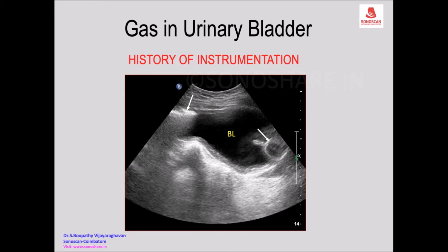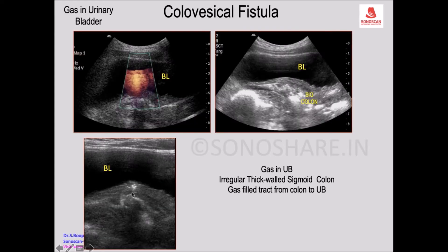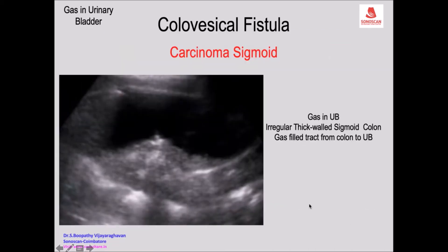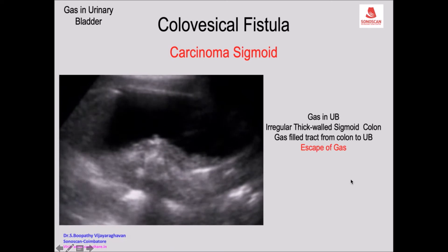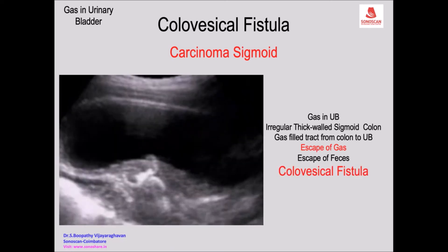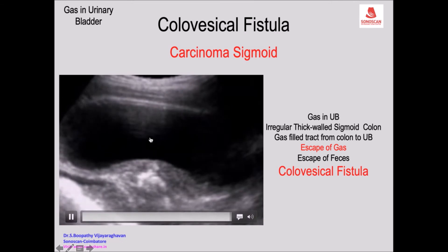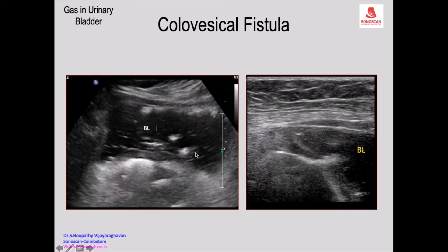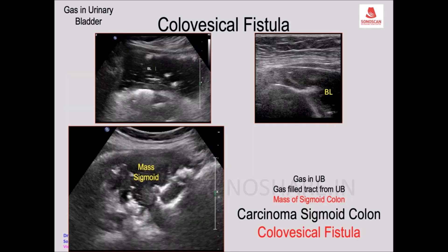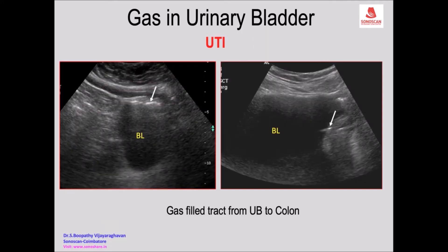If there is no catheterization history, look at the sigmoid colon - you should suspect a colovesical fistula. You also see fecal masses escaping into and also fecal masses present in the urinary bladder. When you see a tract extending, you can give a diagnosis of carcinoma of sigmoid colon with a colovesical fistula, as there is a slightly thick-walled colon.